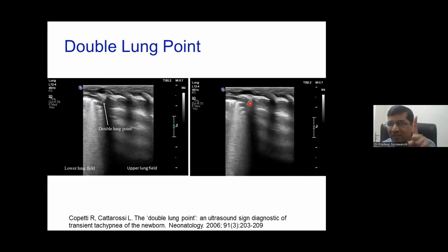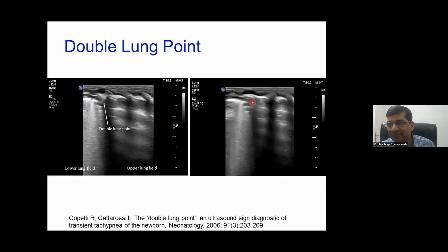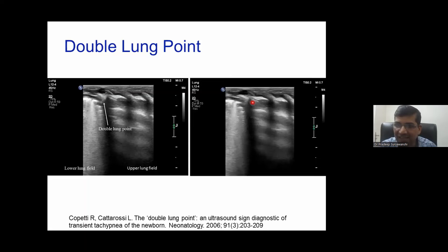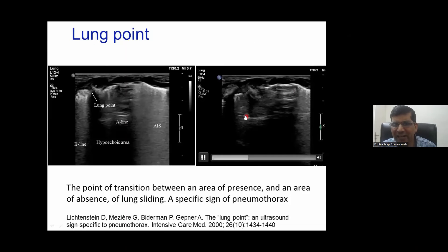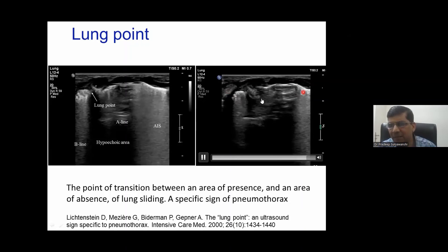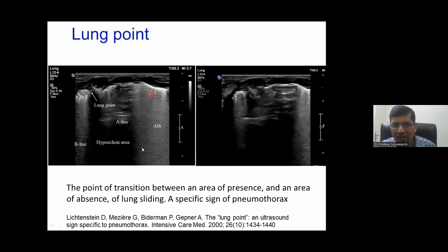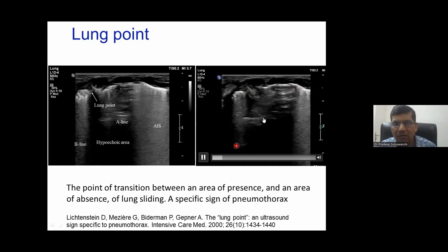To clarify the difference: if lung sliding is present with both A-line and B-line patterns, that is the double lung point. Looking at this picture, we can see the B-line pattern where the lung is sliding, and on the other side, the A-line pattern with no lung sliding. The pleural line without lung sliding and an A-line pattern is called the lung point. So B-line with sliding transitioning to A-line without sliding defines the lung point.